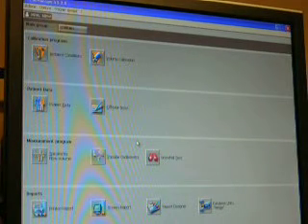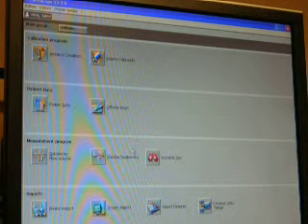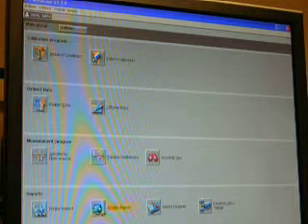Okay, now we've done 2 maneuvers. Remember, we'd like to see 3. You can do up to 8, but today we just did a couple for demonstration. We edited the second one, and now we can take a look at the results and go to Screen Report.